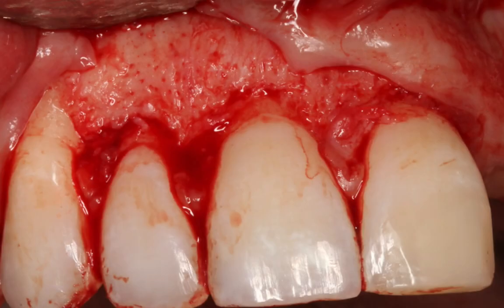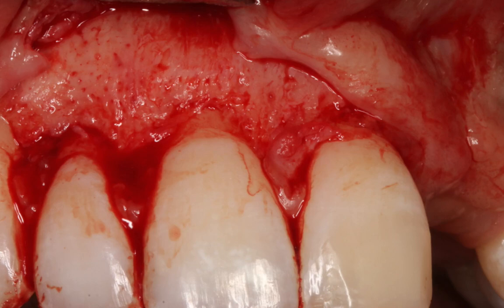What does that mean? That means that this patient has delayed active eruption and delayed passive eruption. That means that this patient not only has excessive soft tissue, but also has excessive bone in the vertical dimension, but also in the horizontal dimension. And both of them need to be addressed as part of this procedure.